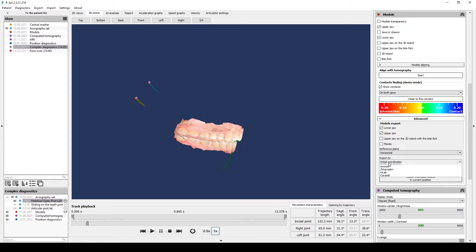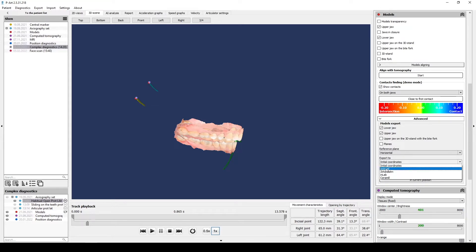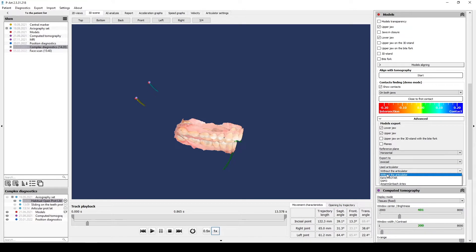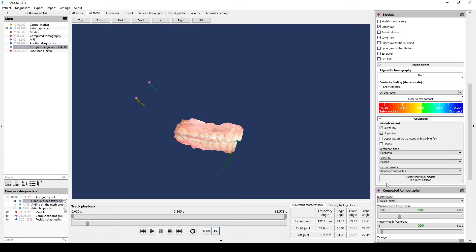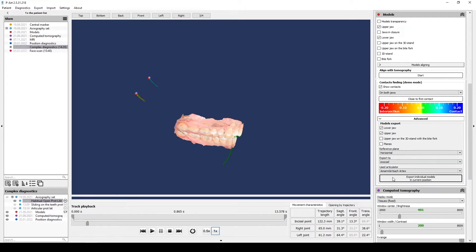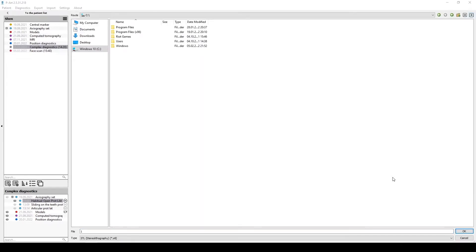Then you select Export to ExoCAD and select preferred articulator. Then you click Export individual models in the current position and select the location where you will save individual models. The models will be saved in STL format.